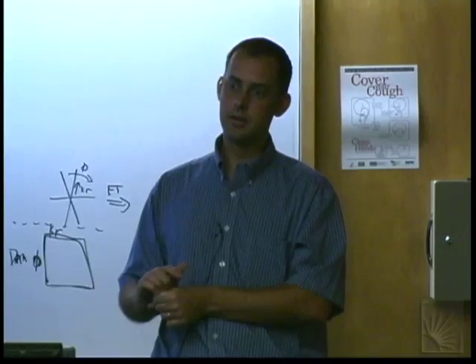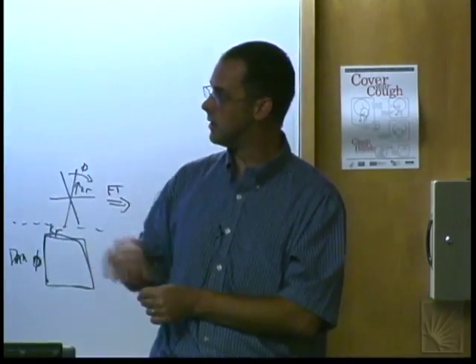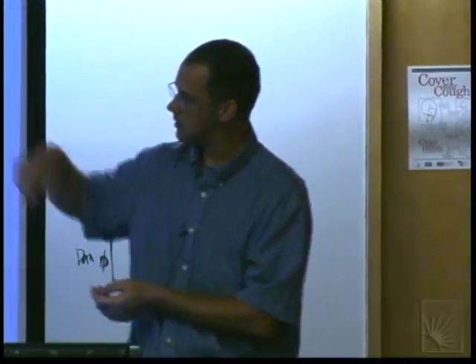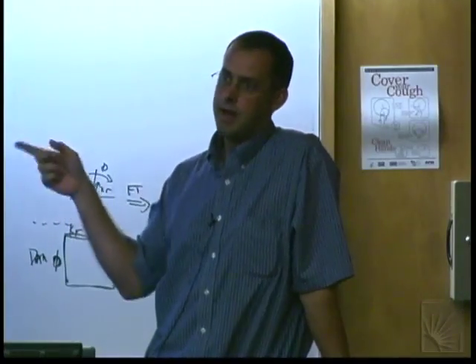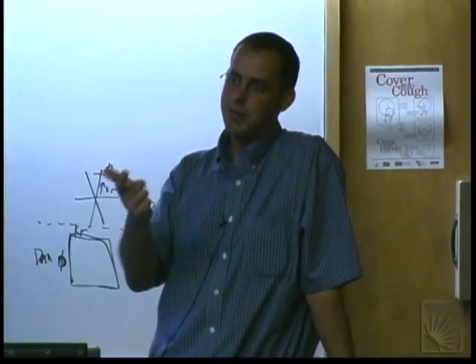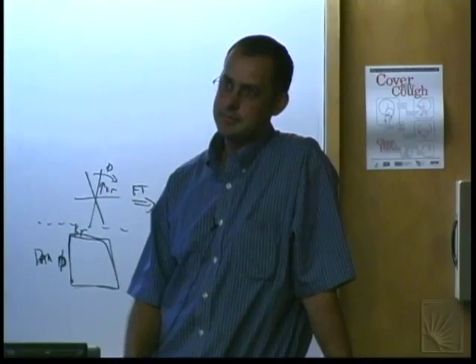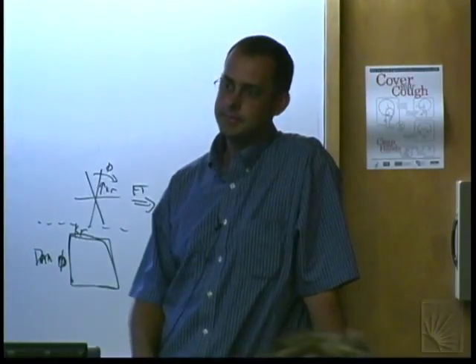Wow. Yeah. The gradient amps are also a Class D configuration. They're actually very similar to this. They have to go negative, so it's a full H bridge. They drive those with a megawatt. They're 95% efficient, which still means you have to cool off 50 kilowatts. And presumably your coils are just turning it into heat. They're water cooled right now. Yeah.